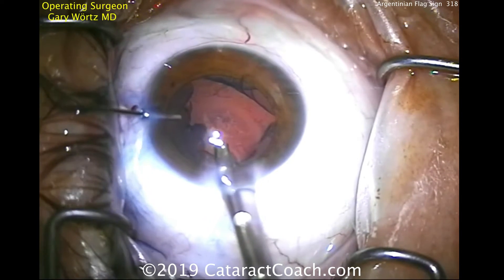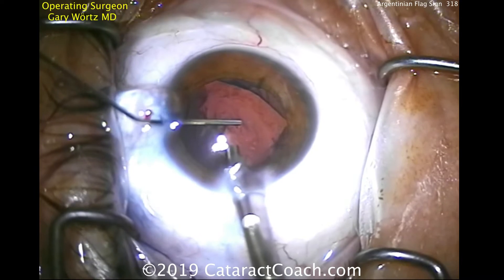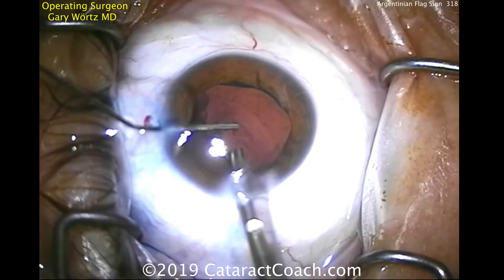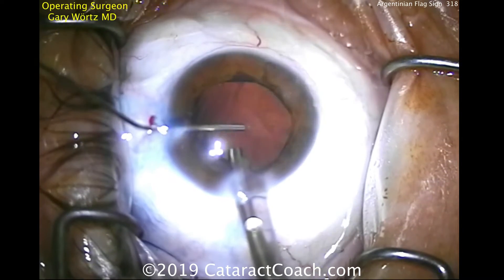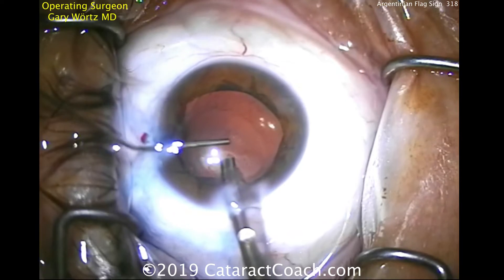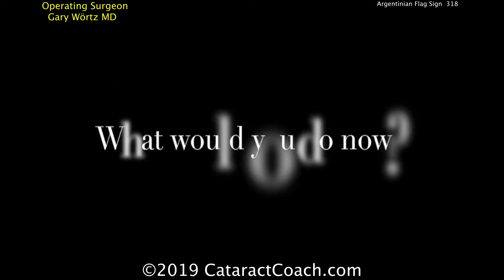Now, importantly, filling the capsular bag prior to removing the phaco probe. Why is that? He doesn't want to flatten out the anterior chamber, because if you flatten out the anterior chamber, that could allow stress to cause that capsular rip to go all the way back to the posterior capsule.